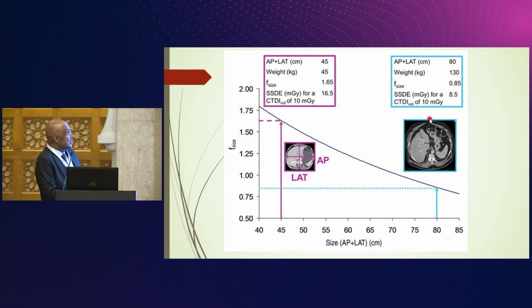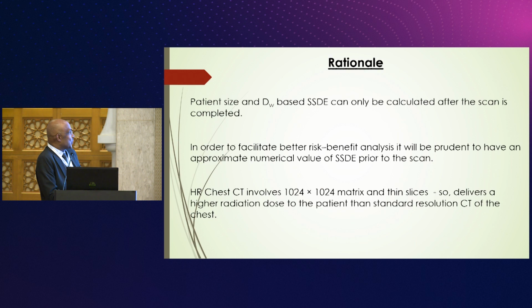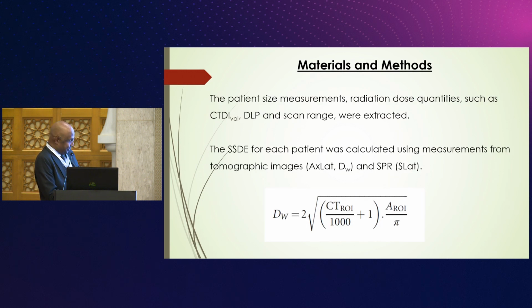including the skin margin, and get an average CT number and the region of interest area in centimeters squared or millimeters squared. And you work with the average CT number in your ROI. That tells you the average attenuation of the patient. And then because your CT numbers are scaled, you do the simple descaling and then multiply by the area of your ROI, and you get the water equivalent diameter. This is a fairly established equation. You can get that from the AAPM reports that you have.